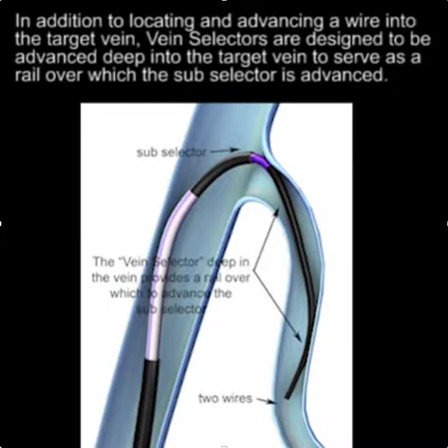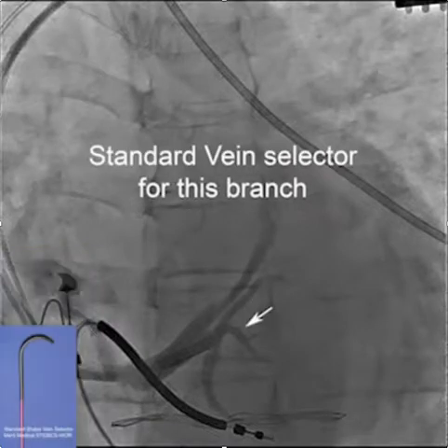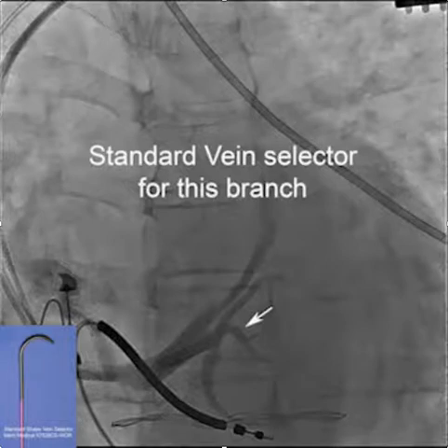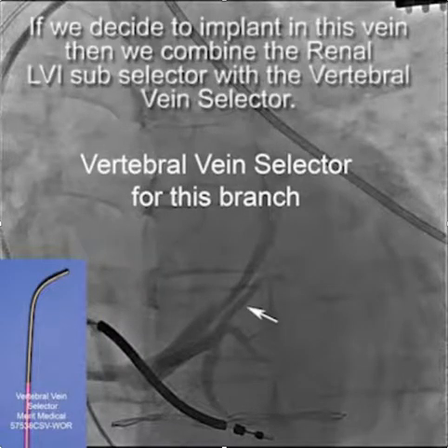So going back to this case, you can see that there's this branch here that seems to be well suited for the vertebral shaped vein selector. And then this branch seems to be well suited in terms of angulation for the standard vein selector. And then the more acutely angulated one might be better suited for the hook vein selector. So it's sort of interesting that all three shapes were illustrated.